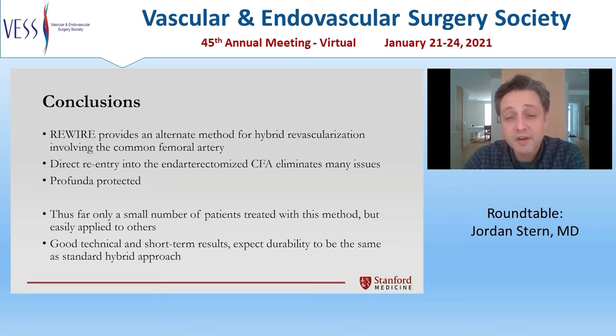Direct reentry into the endarterectomized common femoral eliminates many issues related to reentry and propagation of the subintimal plane. And finally, the profunda femoris can be protected under direct vision. Thus far, we've only treated a small number of patients with this method, but it could be easily applied to others. We've achieved good technical and short-term results, and we would expect the durability to be similar to a standard hybrid approach, as the end result is basically the same.